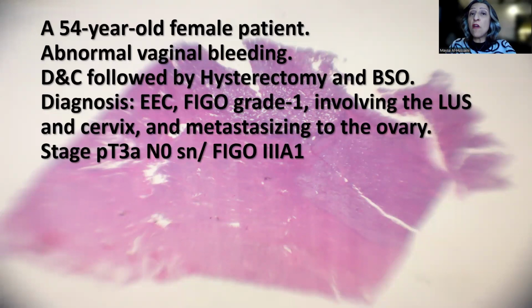And still, Vimentin and CEA and PR are extremely helpful. Remember also that P16 can show this block positivity in the squamous epithelium as well as the squamous morules in endometrial endometrioid carcinoma, and this does not make it positive as is the case in endocervical adenocarcinoma.